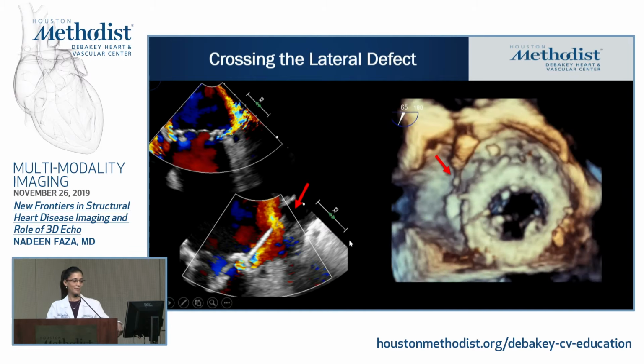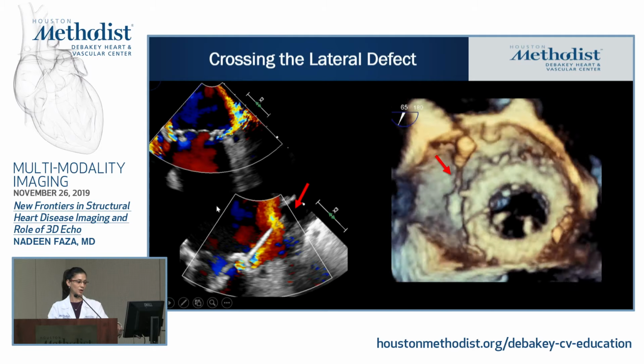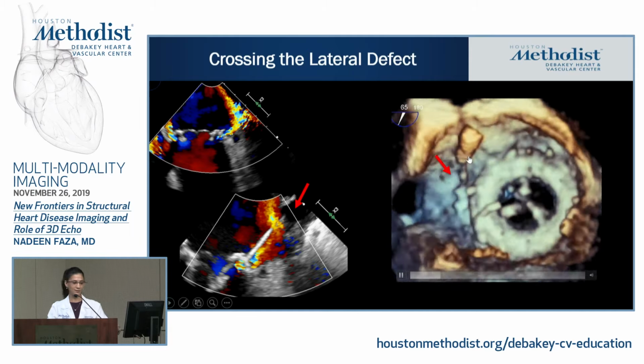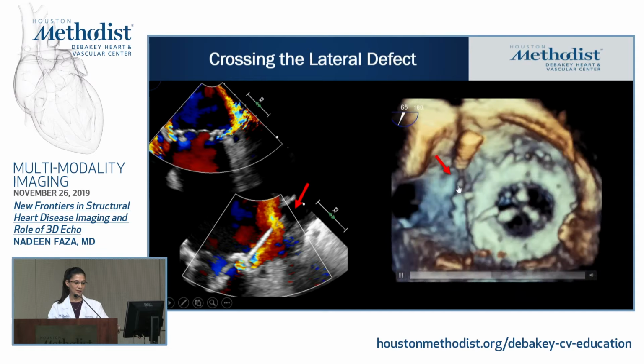So this is live 3D guidance. Again, you have the two defects, the lateral one and the smaller medial one. We were able to pass the wires and the catheters into the bigger one, which was the posterior lateral. You see that this is the catheter, and this smaller line right here is the wire.